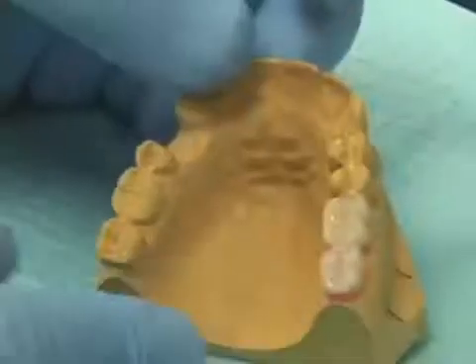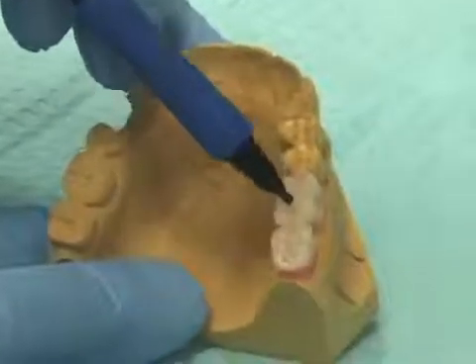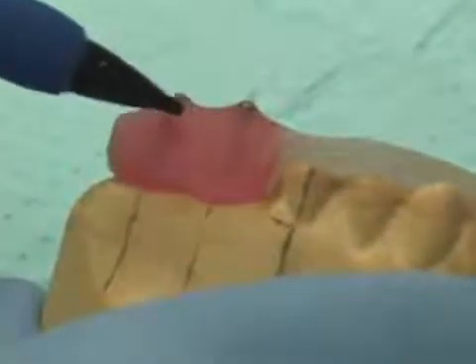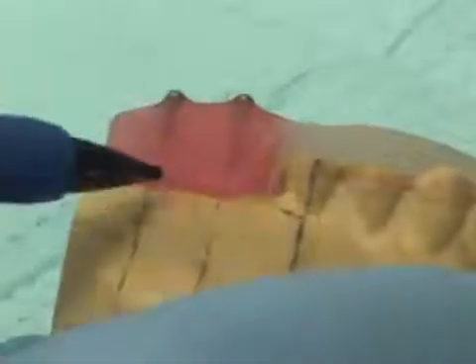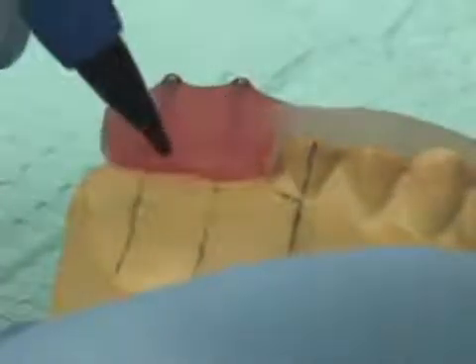Many times, to determine the location of the implants in the posterior area, we may do a diagnostic setup. In this case, we set a couple denture teeth in the area where the teeth were missing in the posterior. So having determined the location of our implants, we went ahead and with another blocked out model, we made a radiographic guide. Note how the buccal aspect of the radiographic guide has been contoured to simulate where we would like the final gingival margin on our restorations to end up.